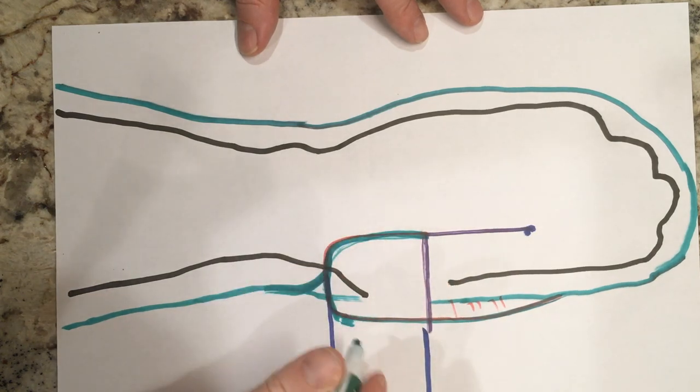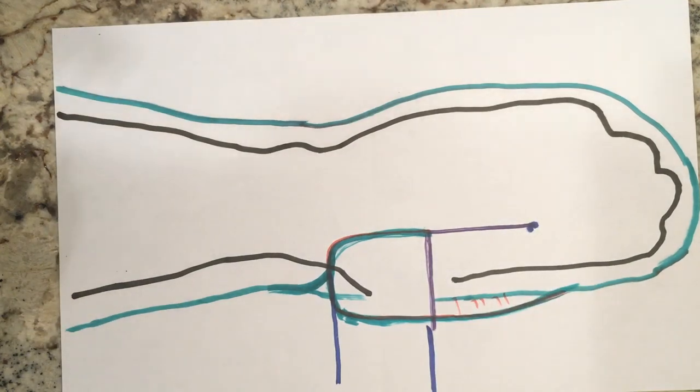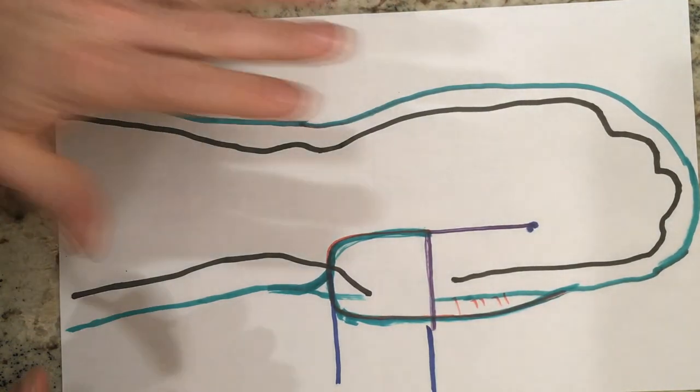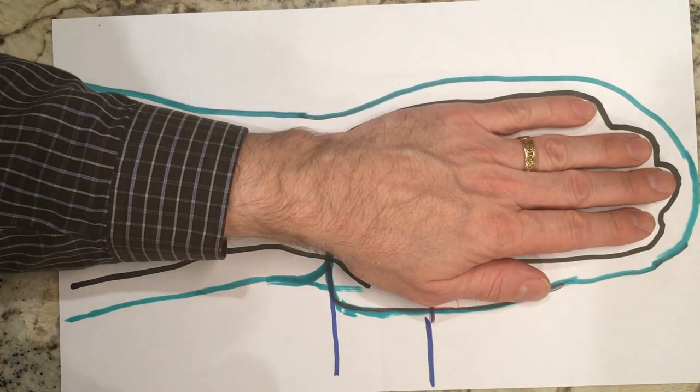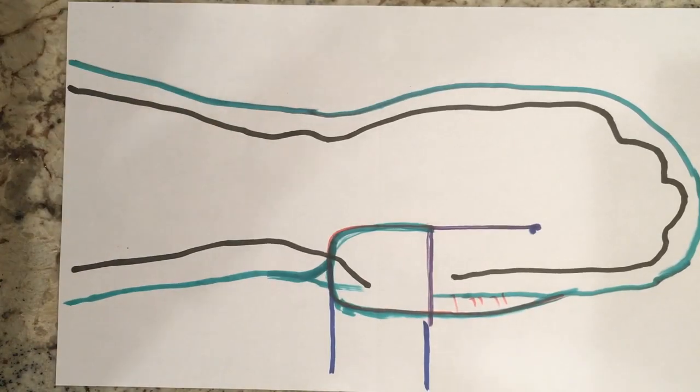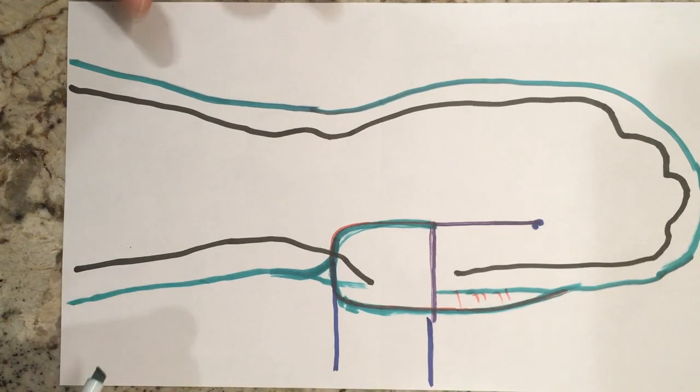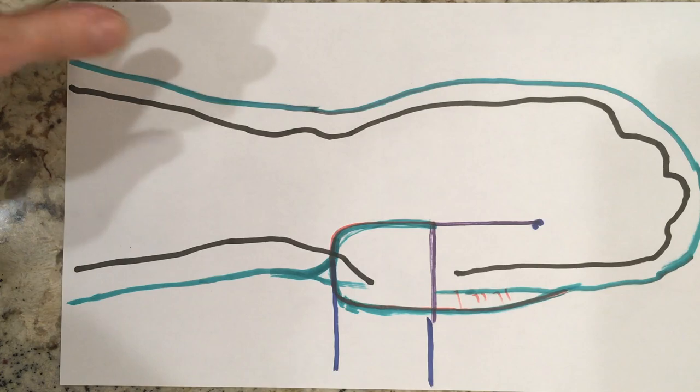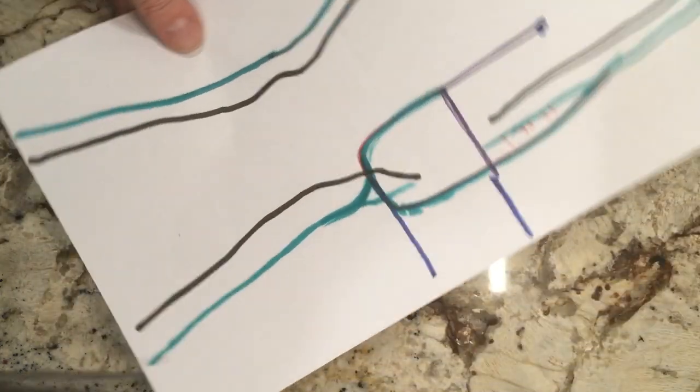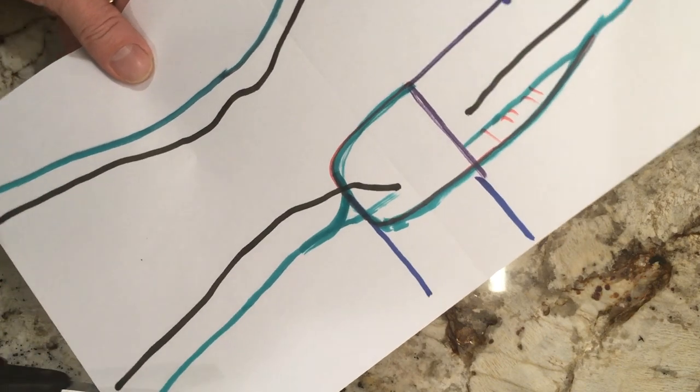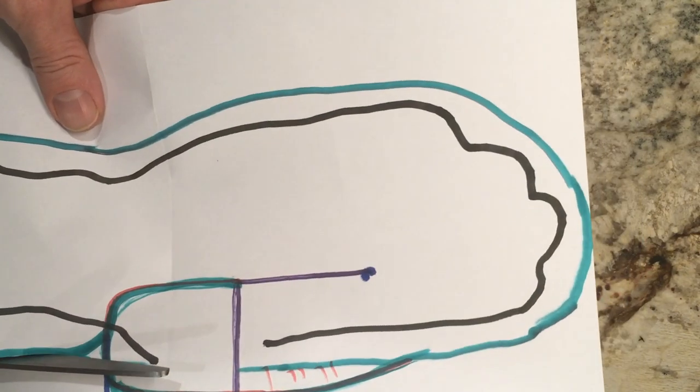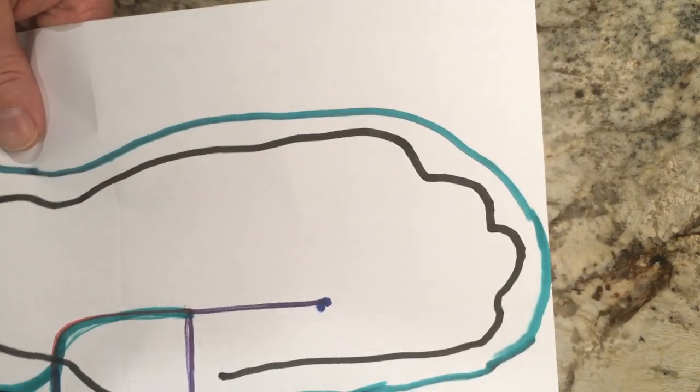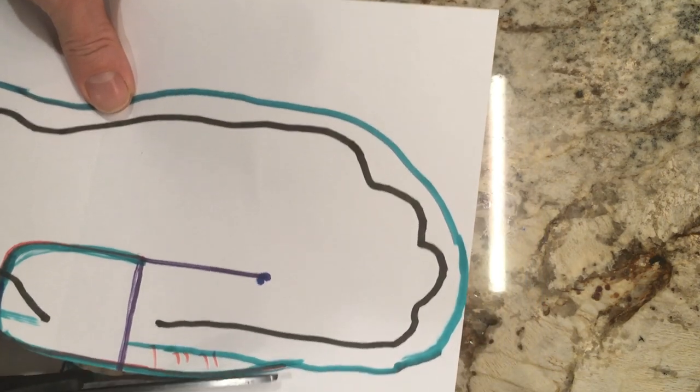The other thing you'll want to check at this point before you cut this out too much is that your forearm length is appropriate, going two-thirds of the way down the forearm to the elbow. This looks pretty close, so I'm going to take this and just start cutting my pattern. You can just take this and actually cut around here, and we'll cut that inside part of the thumb later on.